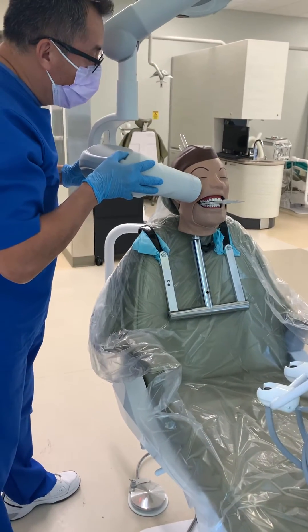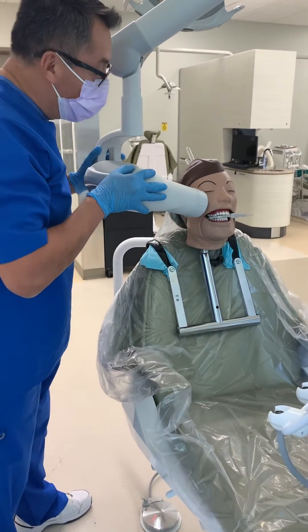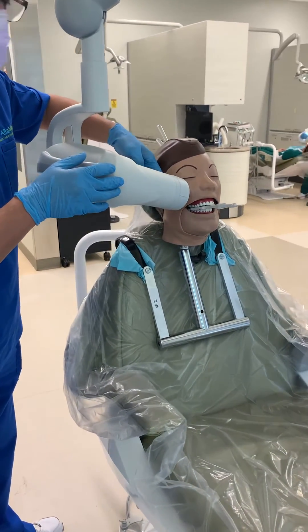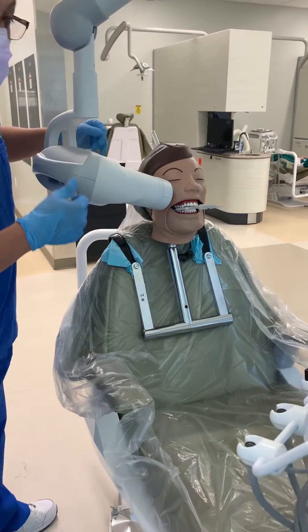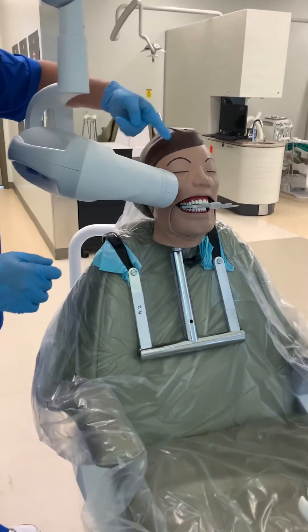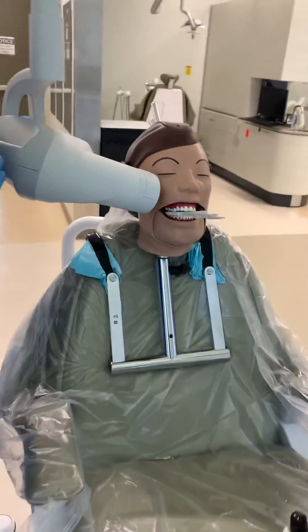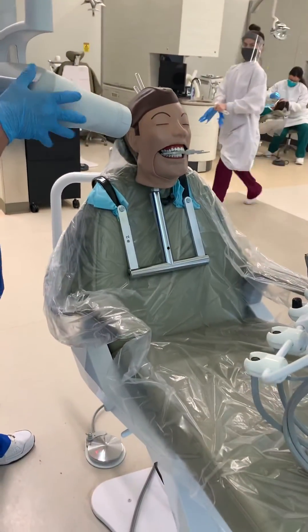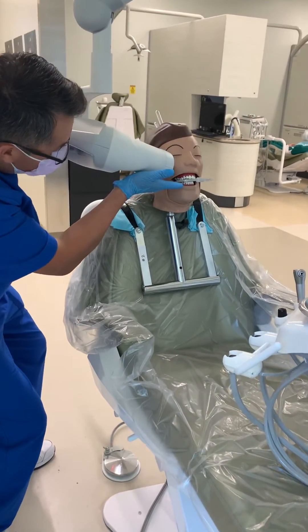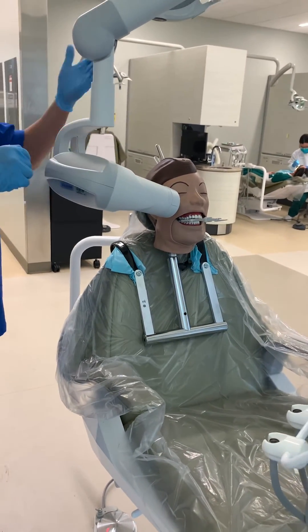Now you're going to get closer to the patient, and always support the machine. With your body, you can just push the machine a little bit, ensuring that you don't obscure the patient. What I recommend to my students is to leave a space about a finger's width — if you're able to put your finger there, then you're good, you're close enough. Check the alignment here, check the alignment there, and then just go ahead and take your X-ray.